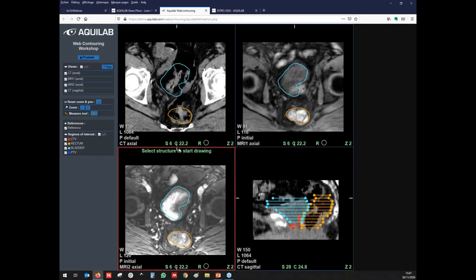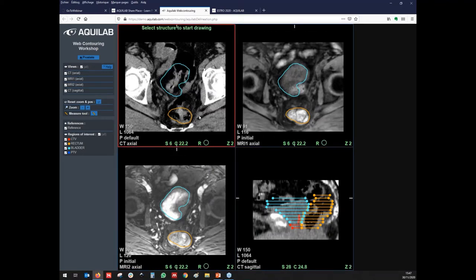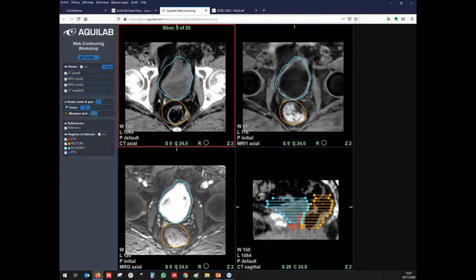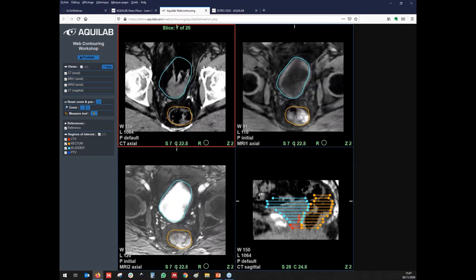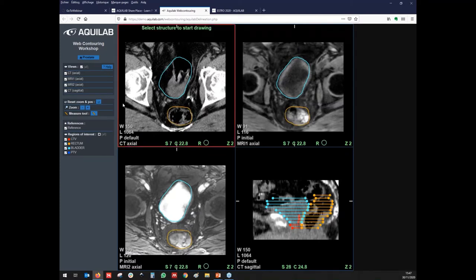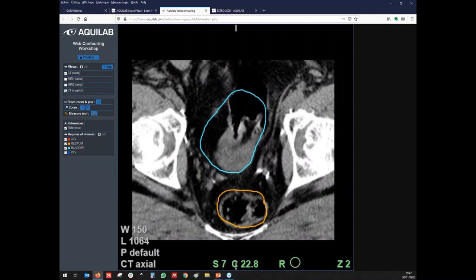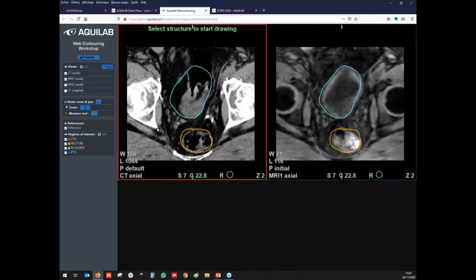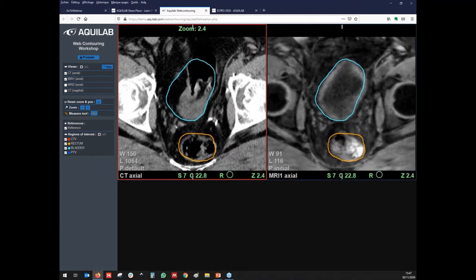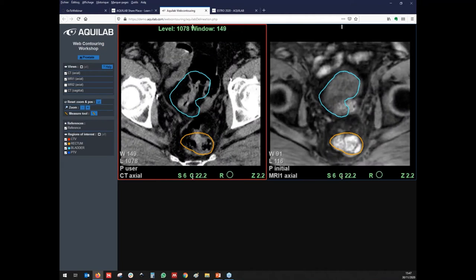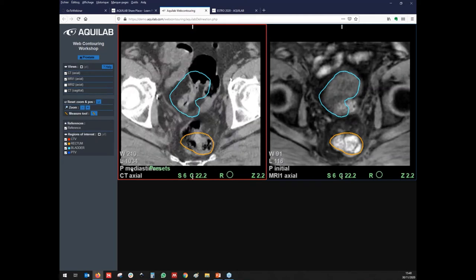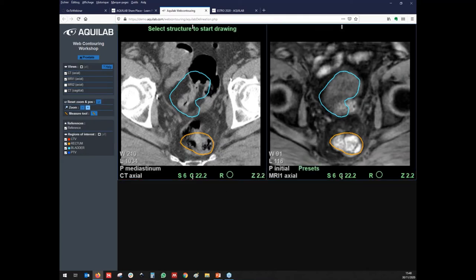Here you can see we have uploaded the CT, two MRIs, the sagittal reconstruction, and different contours which are already done — it's a sort of atlas. Users can look at the different structures and remove them. You can decide, for example, just to see the CT or to see the CT and one MRI. The system can easily zoom, change slices, and change the window level. There are also presets for window level, and for contouring you will be able to change the size of the brush.